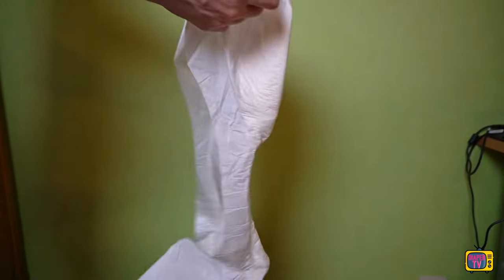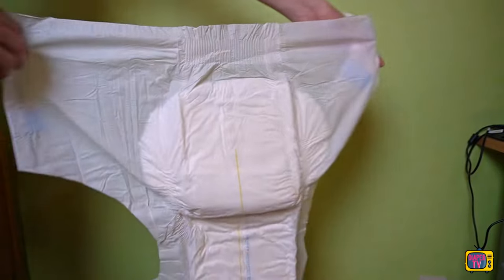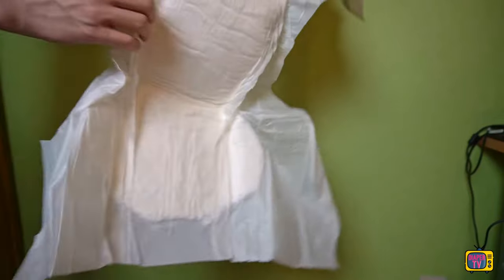I filmed it, but unfortunately I can't show it here because YouTube restricts my videos. So I cannot show you, but instead tell you: when peeing in the diaper, the yellow stripe turns blue and blurs a little.